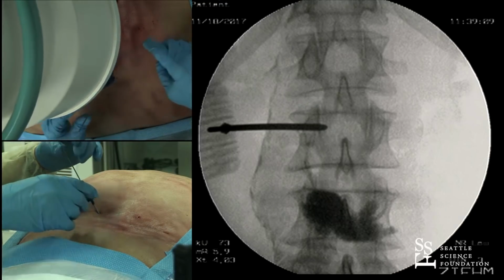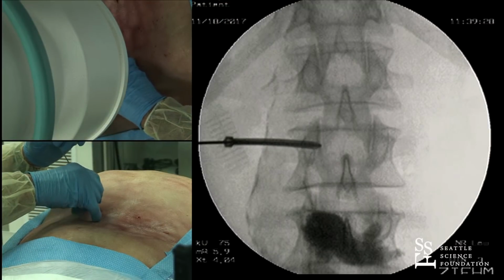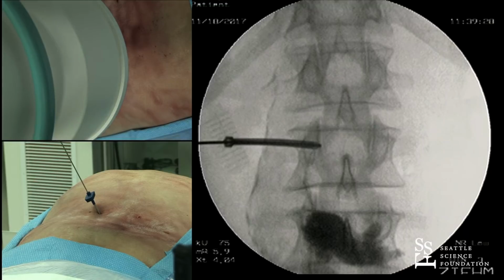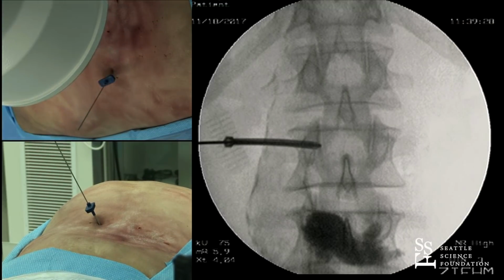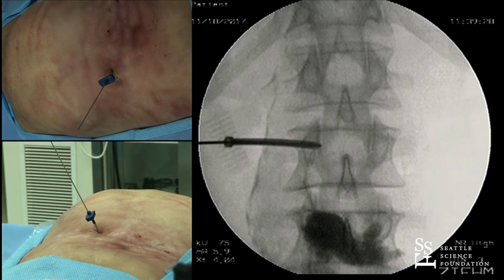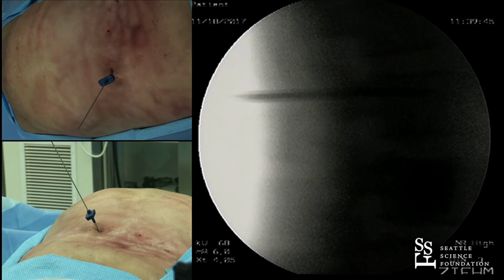What's the risk of pedicle fracture with that much manipulation? So in this type of bone, yeah. Let's go lateral, please. We'll use the lateral to do the change outs and to make sure we don't lose access. It accommodates that much movement easily. What happens to the pedicle after? It fills it. It fills it by itself?